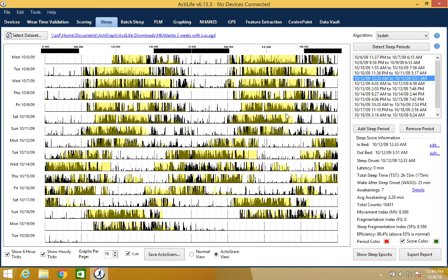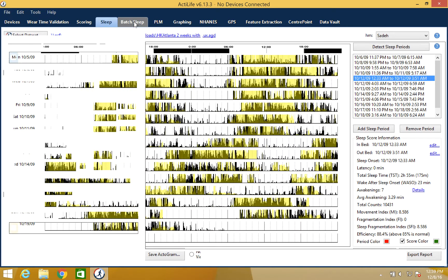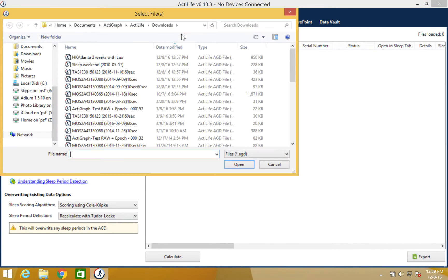The final feature that we will cover is batch sleep scoring. This is another feature that was designed to save the user a lot of time by processing multiple files at once. For this, we select the batch sleep tab and then we add our data sets.